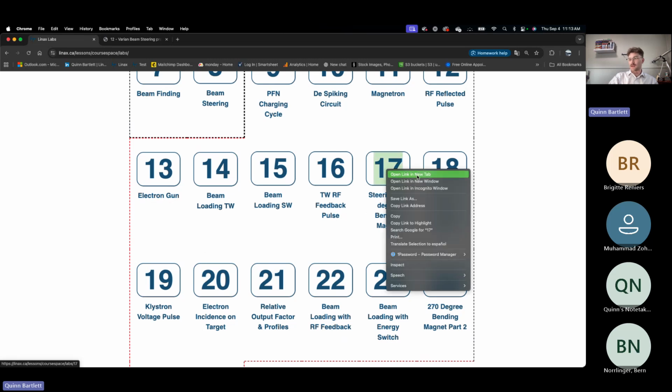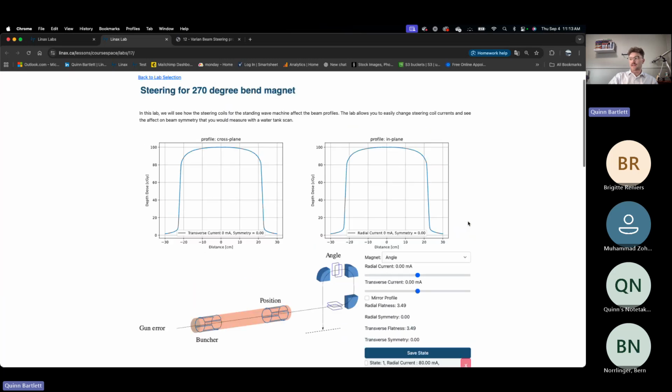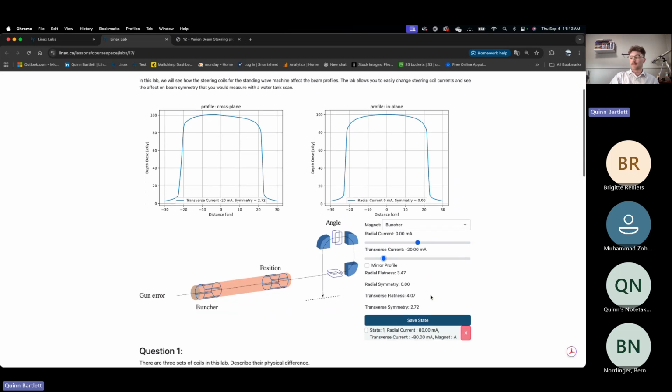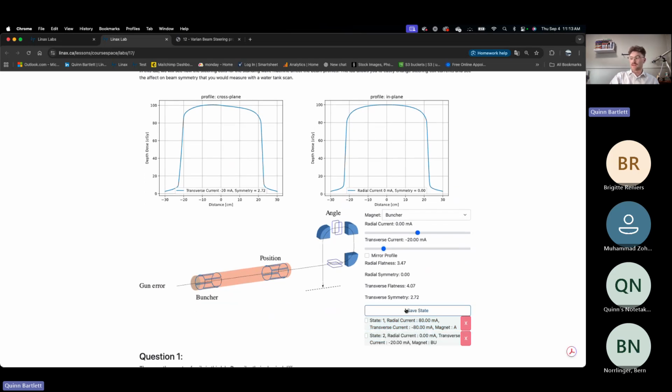So if we were looking at, like, again, the Varian type Linac, our steering lab just takes you a little bit more where you're here, and then all it allows you to do is adjust that radial current or that transverse current, and then see how that affects our profiles in real time. So it's a more interactive and simpler setup. And then of course we can change the magnet that we're giving coil or current to, and then again investigate those.